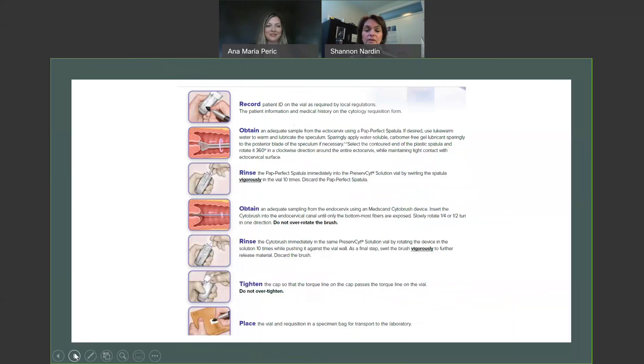Now that we've reviewed prepping the cervix and the use of lubricants, the collection piece is the last piece, and that really hasn't changed. We are still going to collect the ectocervix with the AR spatula — this is a 360-degree rotation around the face of the cervix, removing it and rinsing it vigorously in the vial. At this time, you can choose to leave the spatula within the vial, and I'll explain why you may want to do that in a moment, or you can discard it.